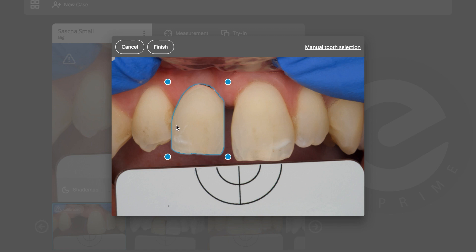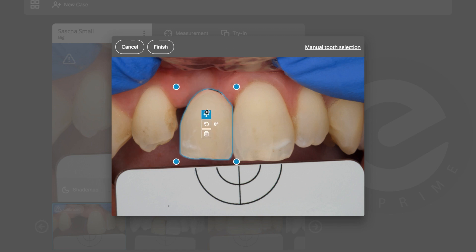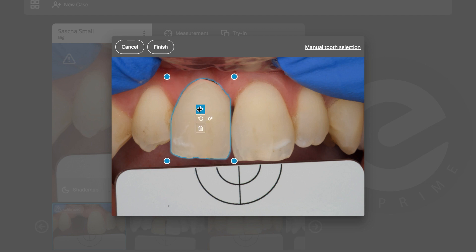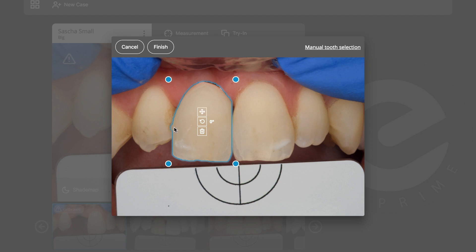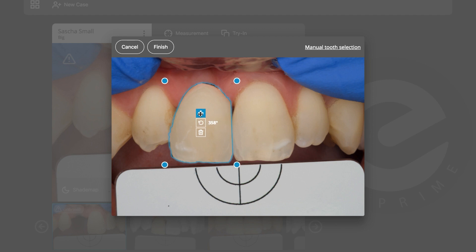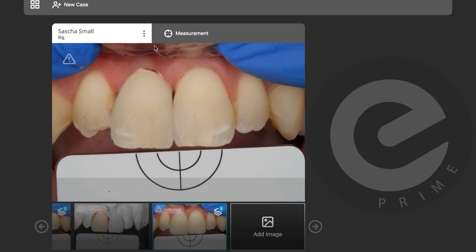I'll do the try-in — take the tooth, make it slightly bigger, position it — it looks like it needs to be a little bit wider. A small rotation this way. Okay, Finish. This is the final digital try-in.